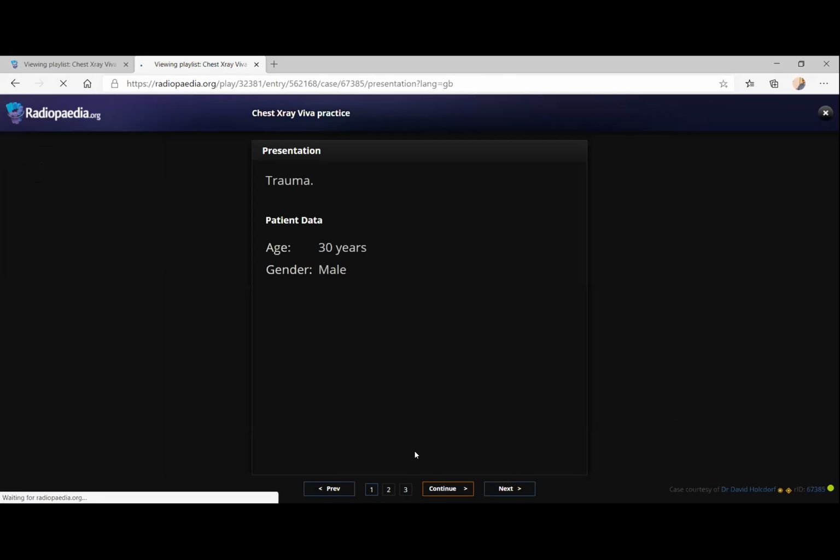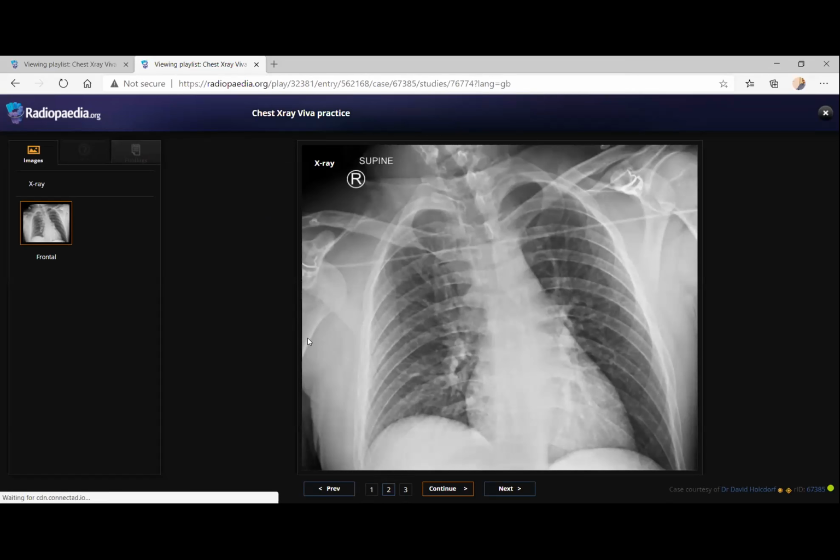And I think this was a trauma case, and that's a review area. With the shoulder dislocation, you have to arrange for a shoulder radiograph, a corner of the film. You have to refer to the ortho and arrange for a proper shoulder series, like AP, lateral, then Y view and all. So all the shoulder series you have to arrange and then refer to the orthopedicians.